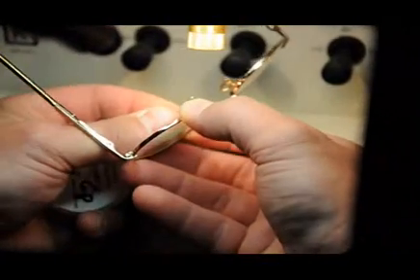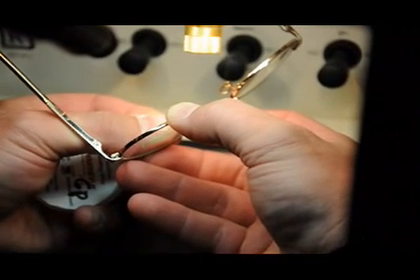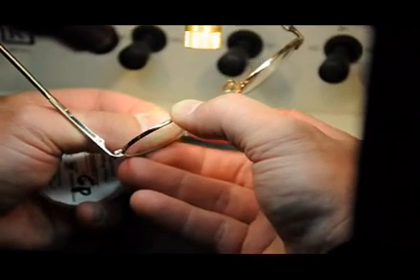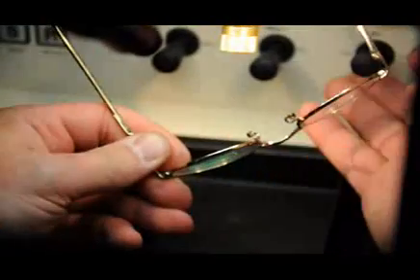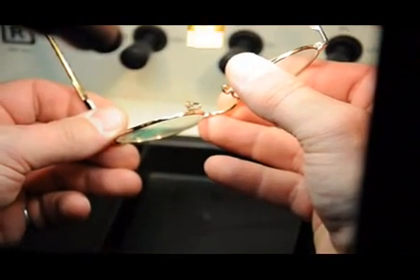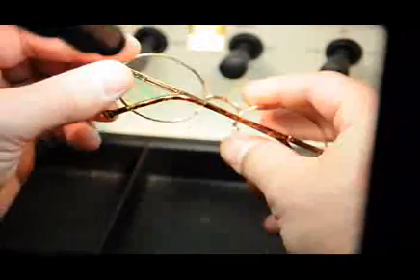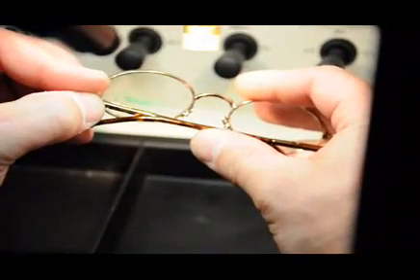The last step is for the operator to perform hammering and smoothing to complete the task. You'll note that this repair is not taking more than 2 or 3 minutes of actual welding time. The operator is inspecting the frame as well as welding it through the 15X microscope assembly.